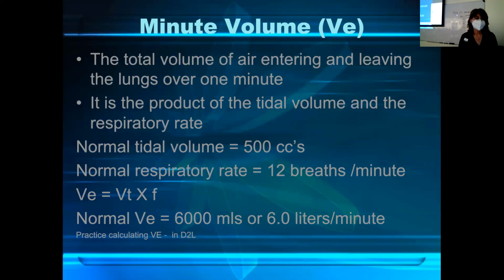And cc's, mLs. Here it says cc's, down here it says mL, so same thing. But 500 times 12 is 6,000 mLs. And then how do you convert that into liters? Divide by 1,000 or move your decimal point 3 places to the left. So in D2L, there's lots of practice questions on this calculation.